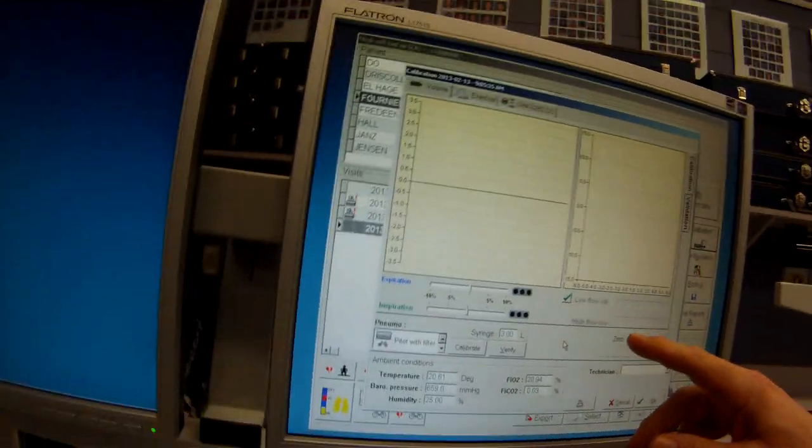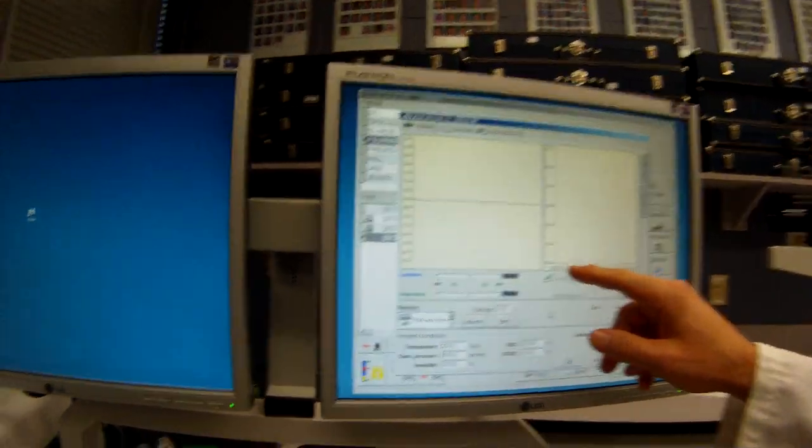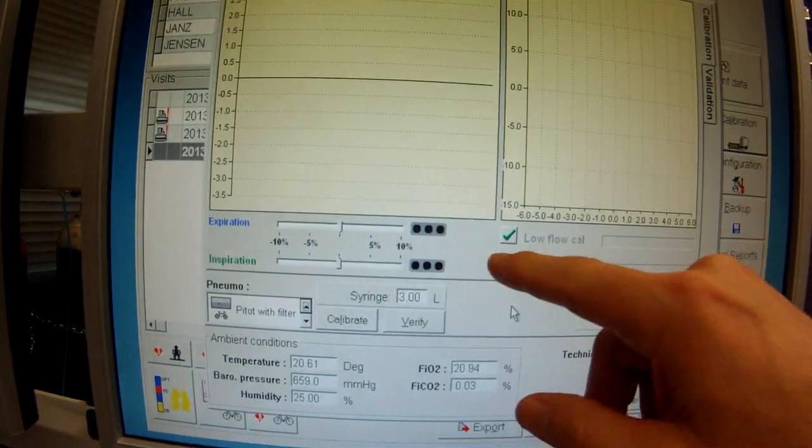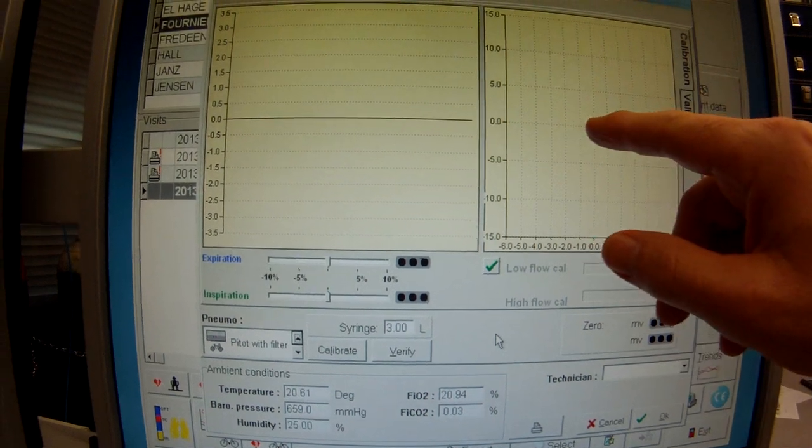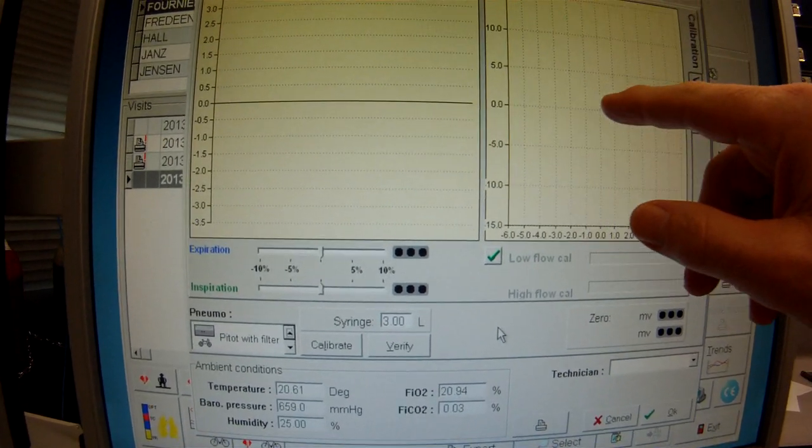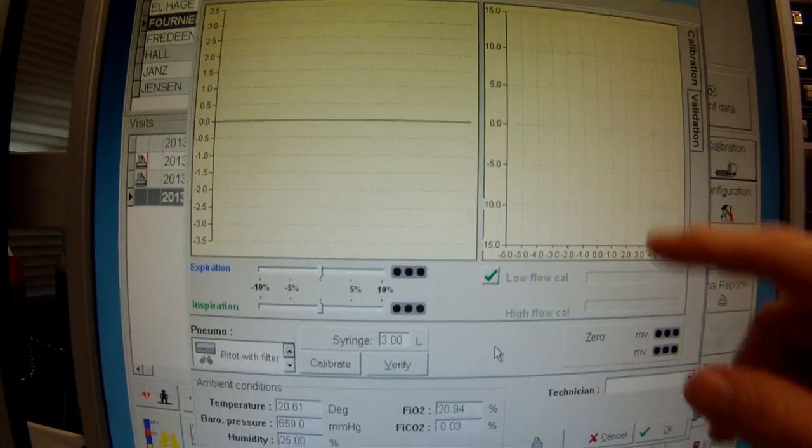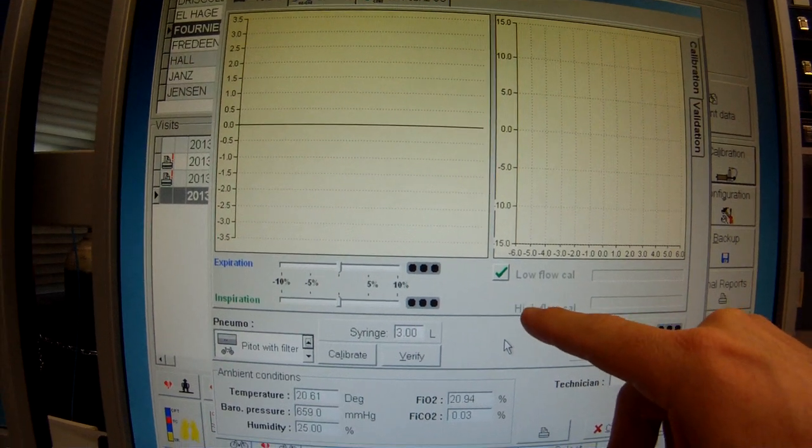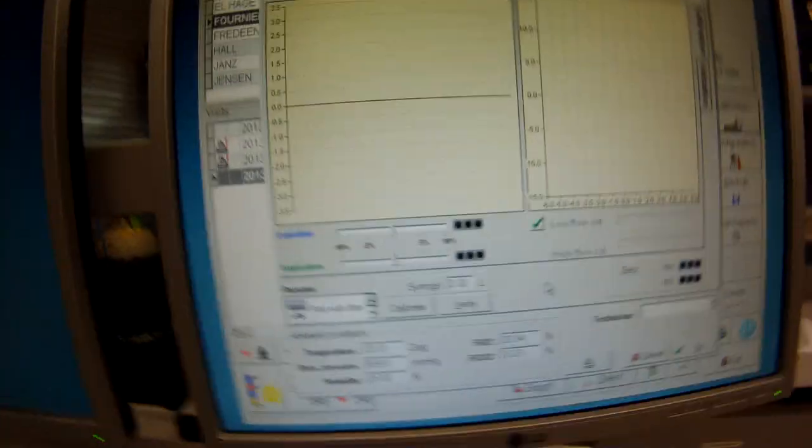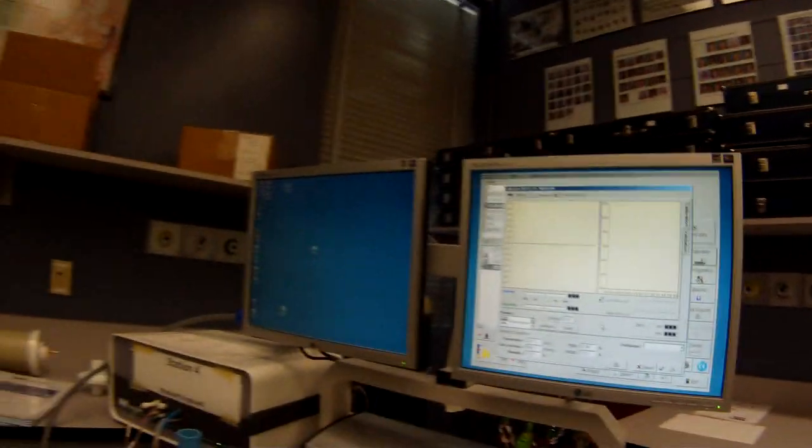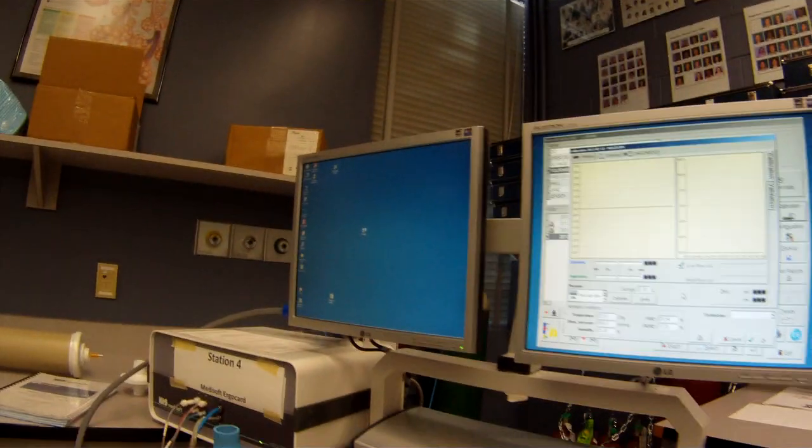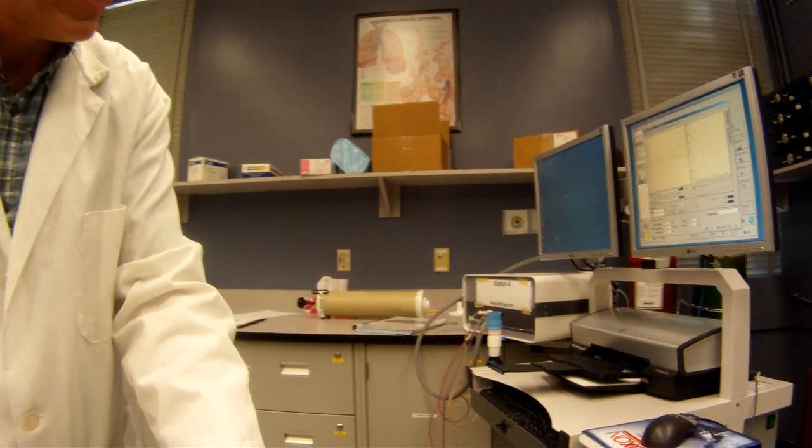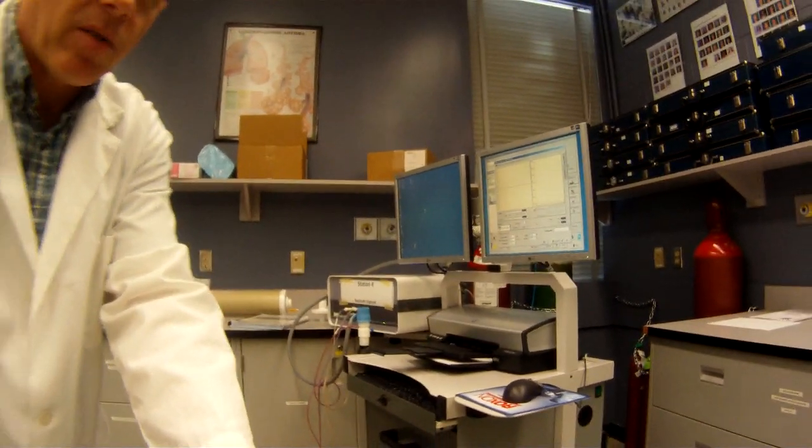Once we get into this here, it shows us our calibration screen. And you notice highlighted is the low flow cal. So initially, we're just going to be doing these little low flow calibrations. And then it'll click over into the high flow. The first round, it doesn't observe anything. It just gives us like a practice warm-up round. So I'll sit you there, just like that. And you can watch us do our calibration here.